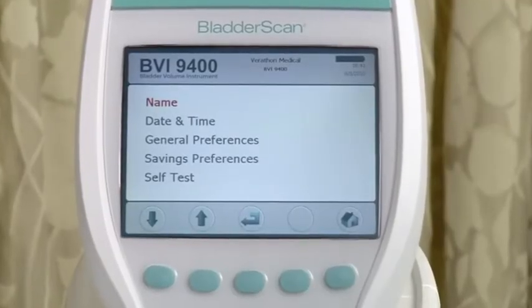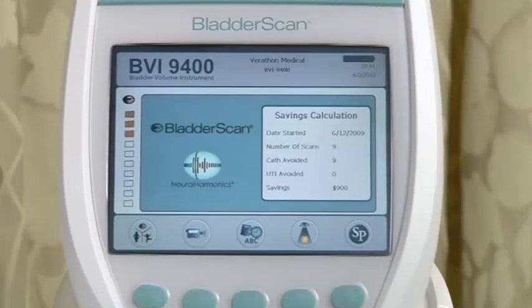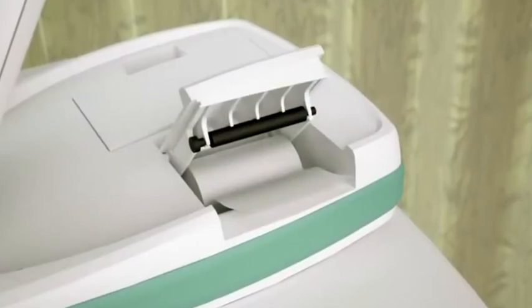Before using the Bladder Scan, personalize the instrument with the name of your practice and the correct time and date, as this information will be shown on all printouts. Check to make sure the battery is charged and there is enough paper in the printer before you start to scan a patient. If the patient is being scanned for post-void residual, or PVR, determination, it is important that the patient urinate before doing the test.